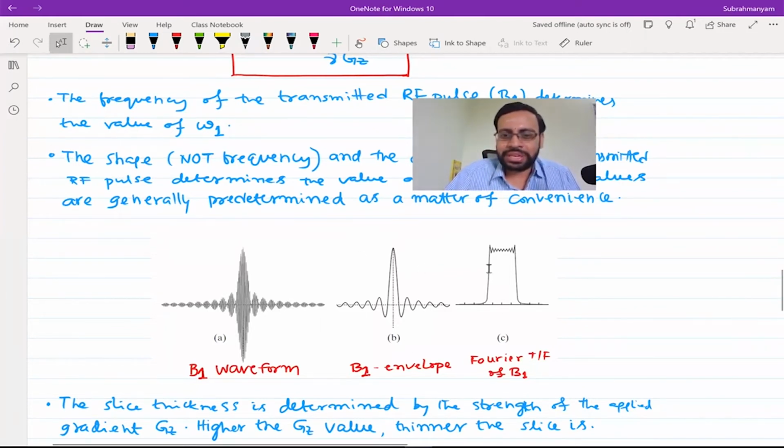And of course here, if you want something like this, this is again an approximation, you should stop at some point of time, you cannot give it to infinite. And of course then you would get some spikes here, and this is the bandwidth you could be getting if you are using an envelope something like this. So this is a very subtle thing. I hope still you could get a feel for it.